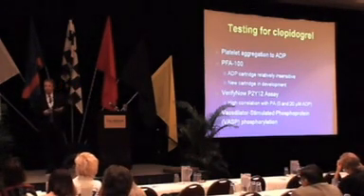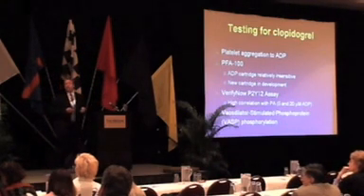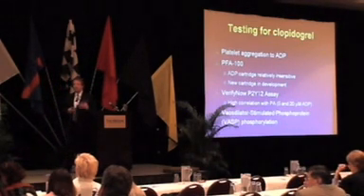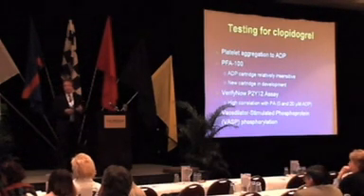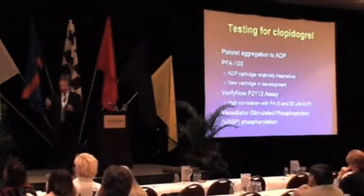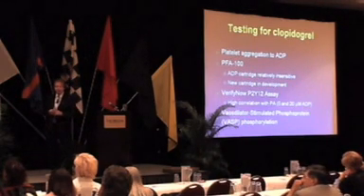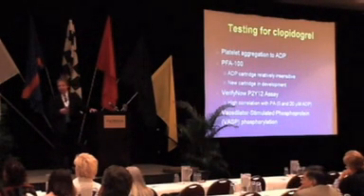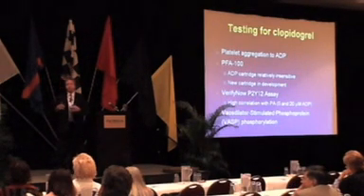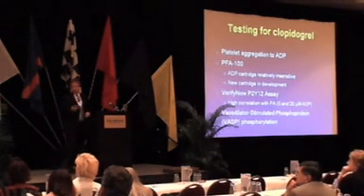The company are working on a new ADP cartridge, it's in clinical trials now, and I haven't seen any of the data on that, but hopefully that is going to make the PFA 100 much more useful for testing for the Plavix effect. And the VerifyNow test system has a P2Y12 assay available, which correlates extremely well with platelet aggregation. And there's flow cytometry methodology available on that, on the VASP phosphorylation.